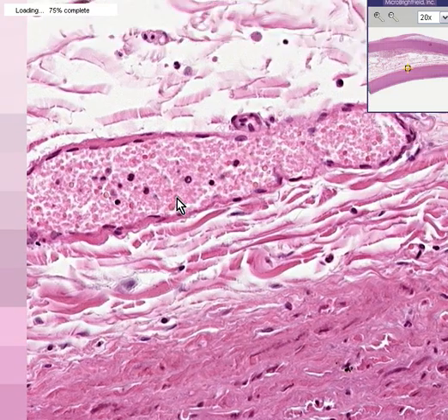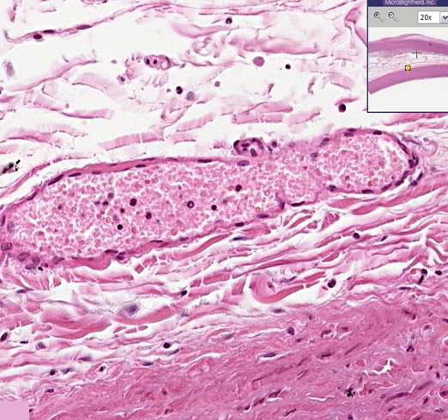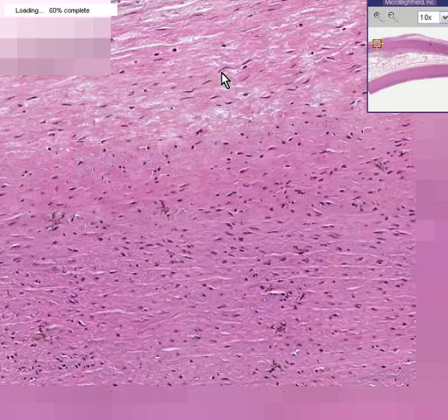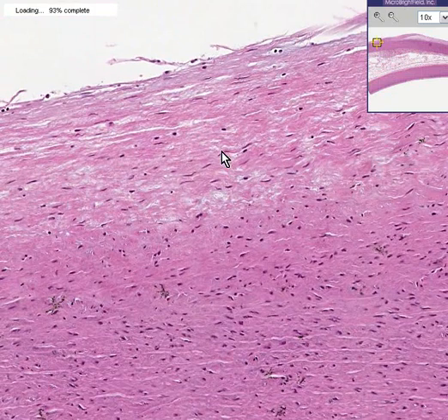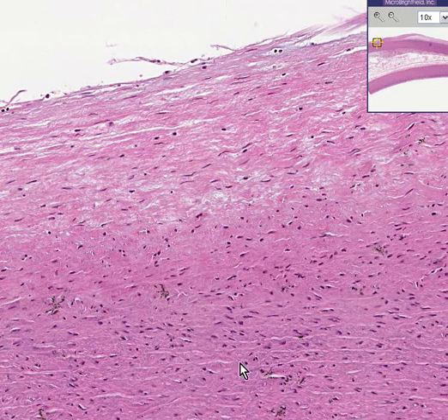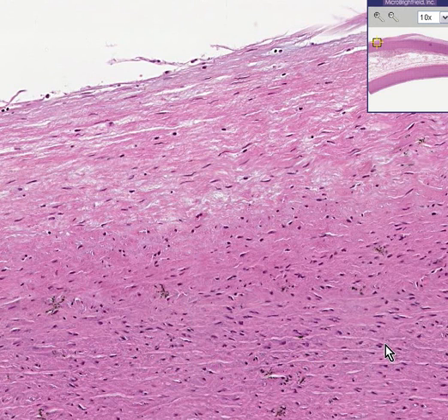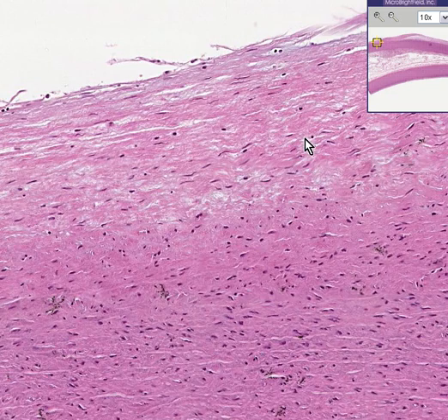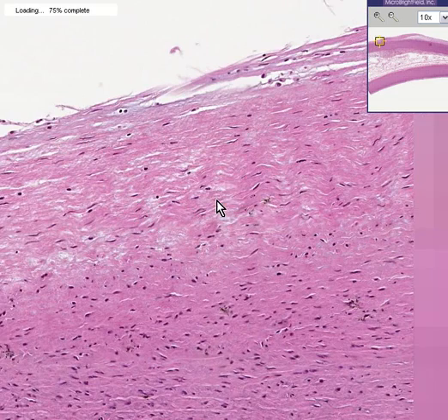Now let's look at another part of this aorta in which once again you can see these little wavy whitish slightly refractile lines representing elastic fibers through the wall, because the aorta and often its major thoracic branches are regarded as elastic arteries.